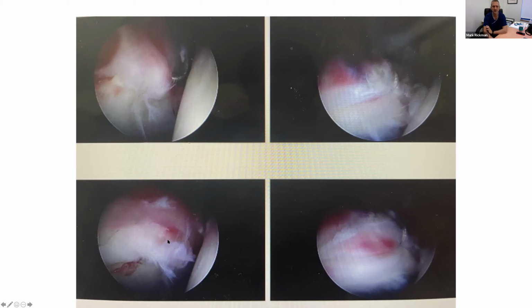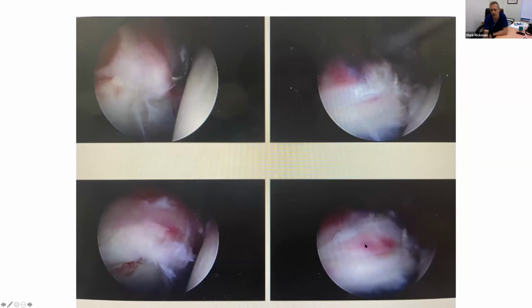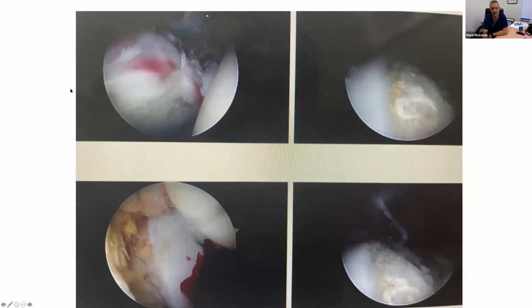And when they get to this stage where they've been impinging for 2-3 years, the articular cartilage bears the brunt of it. And there's not very much you can do about that arthroscopically or open. It's just damaged cartilage. It doesn't grow back. So you repair the labrum as best as you can and tidy this up, and just hope that nature does the rest for you. So essentially you end up with this sort of situation with 2 or 3 anchors and stitches up here, and then you tidy this up and just hope the body does the rest.